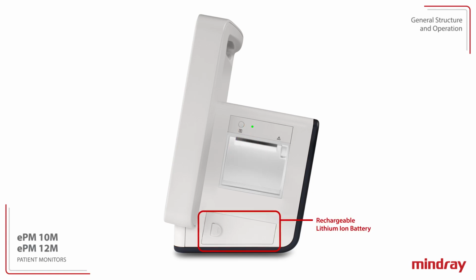The battery compartment supports a rechargeable lithium-ion battery, providing up to 4 hours of continuous monitoring. The battery charges when the monitor is plugged into an alternating current power source.